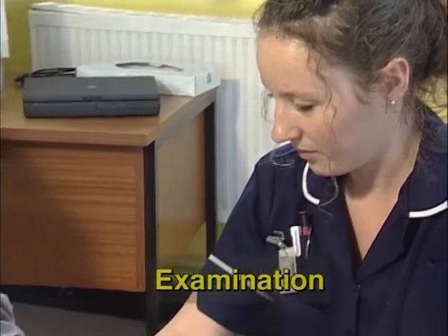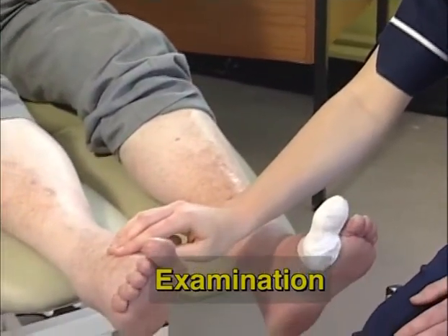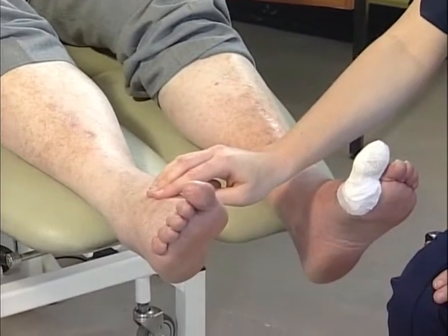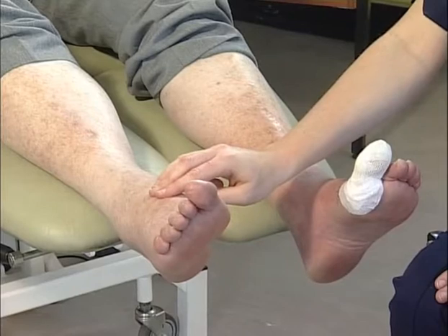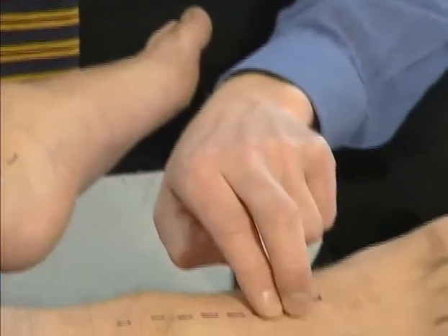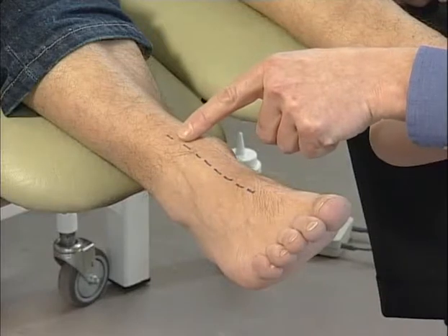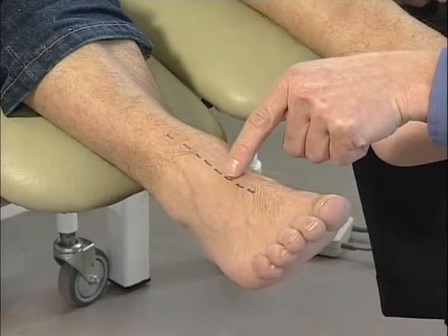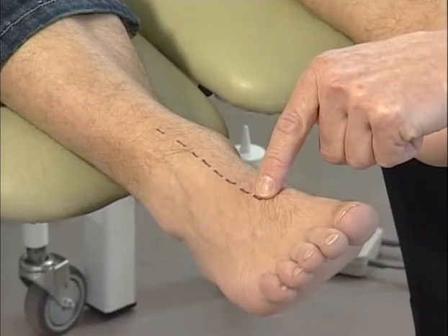To assess whether or not a patient has adequate blood flow, you should always feel for the foot pulses, then use a Doppler. So let's have a brief reminder of where the arteries are located on a patient's foot. Firstly, the dorsalis pedis, which arises from the anterior tibial artery that runs down the front of the leg. Here you can see, drawn on the patient's skin, where you should be able to detect the dorsalis pedis pulse.